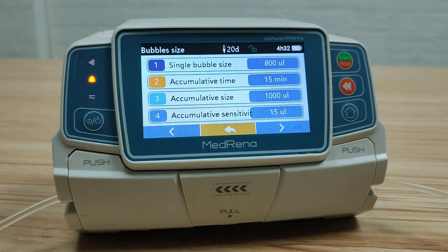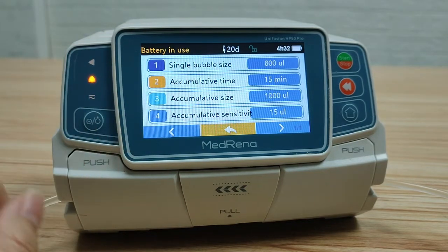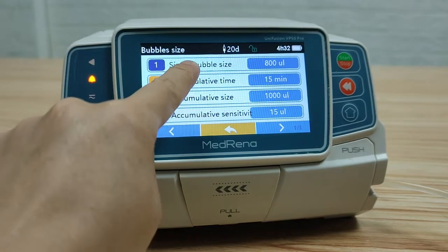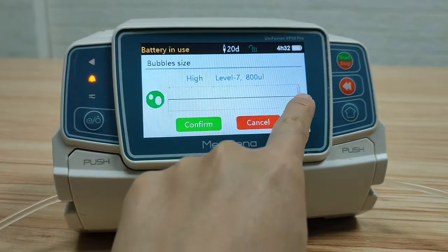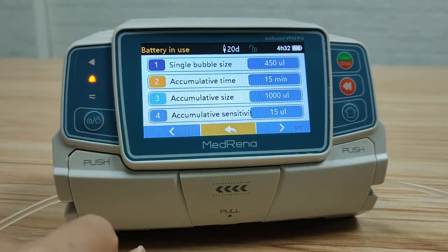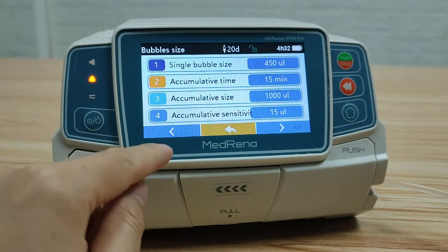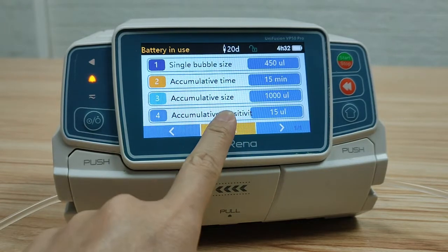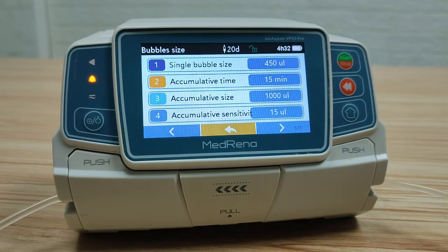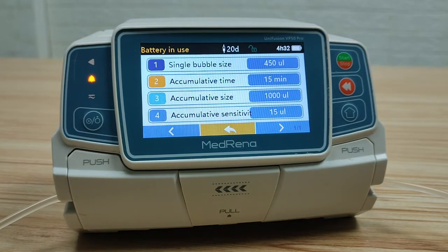Bubble size: in this setting we can select either single bubble size or accumulative bubble size that will trigger the alarm. For single bubble size, there are seven different levels to choose from. We can also select accumulative time and accumulative sensitivity that will trigger the alarm. The pump provides multiple options for professionals based on different patient populations and different clinical situations.